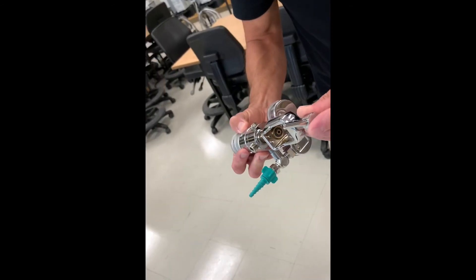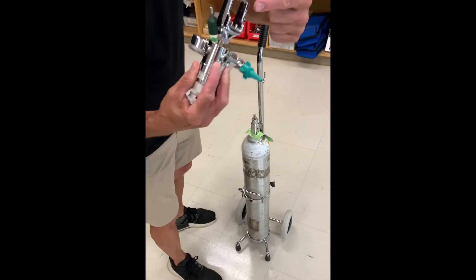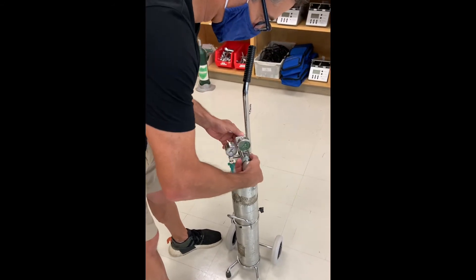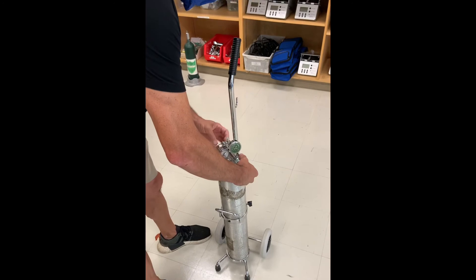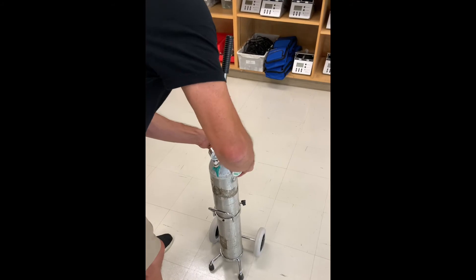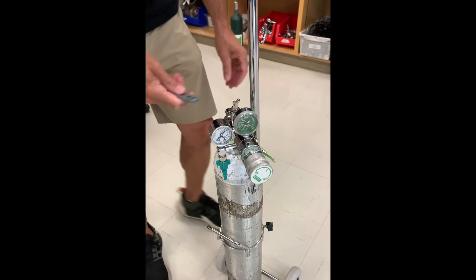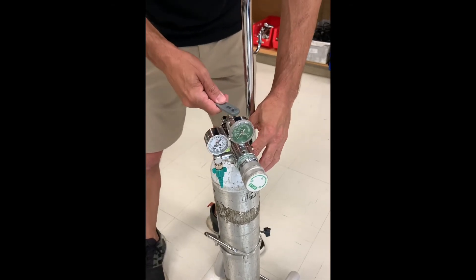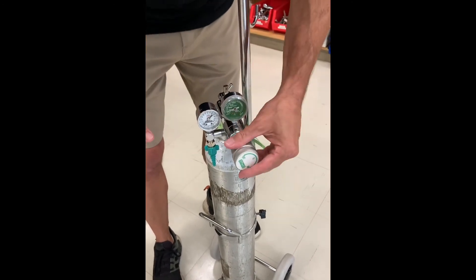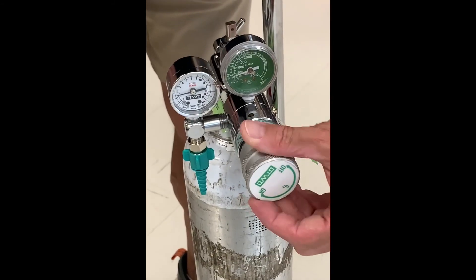Now you can attach your regulator. The regulator has pins that align with the pin holes on the cylinder post valve. The gas outlet from the cylinder post goes into the regulator and gets reduced in pressure. You can control the pressure and the flow leaving this device. It should be a fairly snug connection, so tighten it with the wrench as well. When you open the valve, you'll see pressure on the cylinder shown on the green gauge, and as you turn the handle, you allow flow to leave the device.